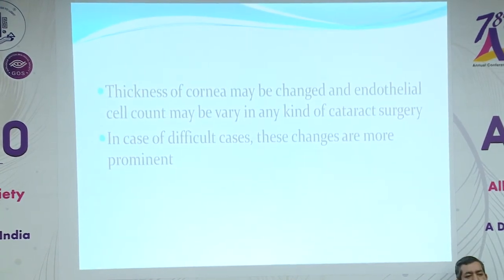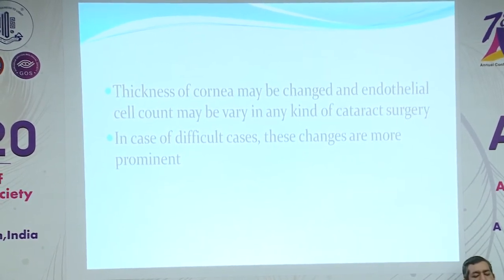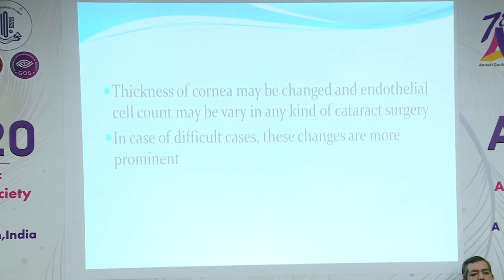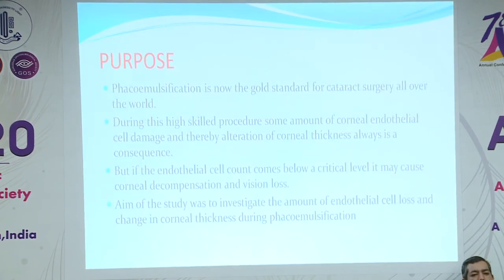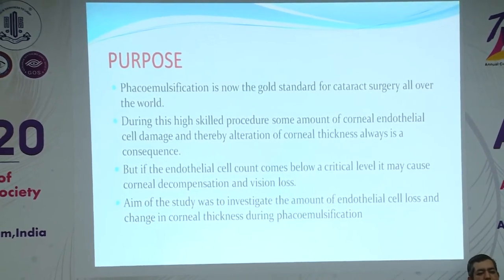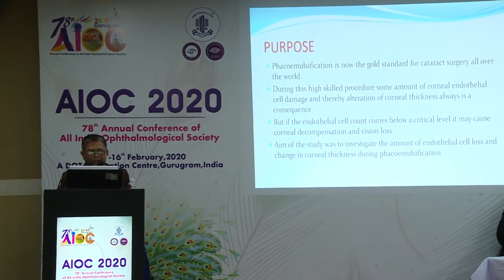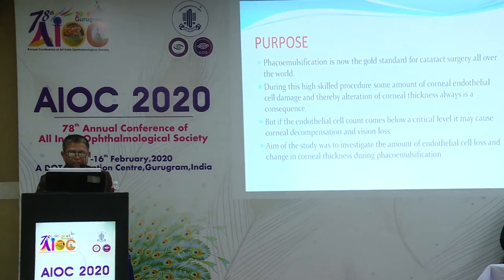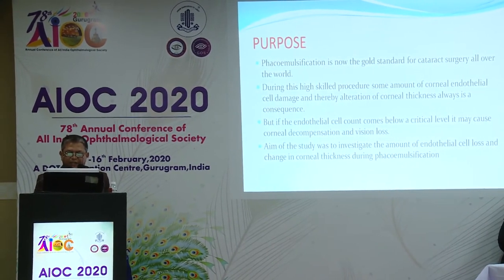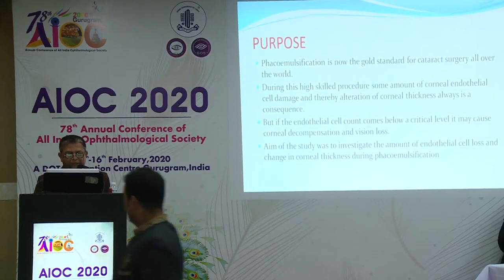Thickness of the cornea can change and endothelial cell count may vary in any kind of cataract surgery. In difficult cases, these changes are more prominent. During this high skill procedure, some amount of corneal endothelial cell damage and thereby alteration in the corneal thickness is always a consequence. But if the endothelial cell count comes below a critical level, it may cause corneal decompensation and vision loss. The aim of the study was to investigate the amount of endothelial cell loss and changes in corneal thickness during phacoemulsification, particularly in the difficult cases.